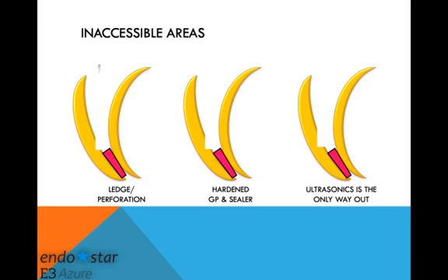However, when I'm trying to negotiate the apical third of the canal, which still has hardened gutta percha and sealer, there is some kind of ledge formation or some kind of hard stop. And no matter how much filing with a K file or H file I try, it is always hitting a hard spot. Even if I am trying to pre-curve the file, because the gutta percha and the sealer are hardened, the file does not advance any further.